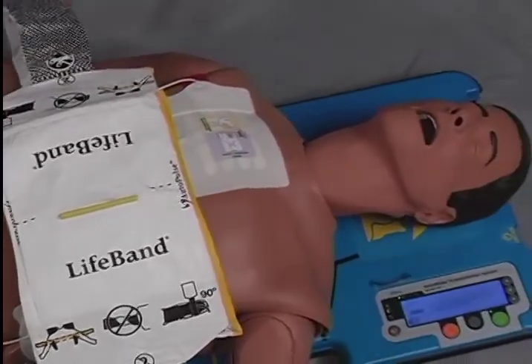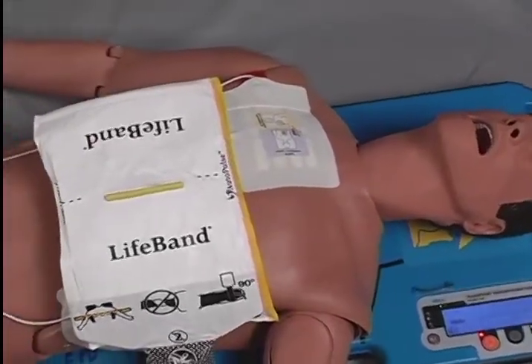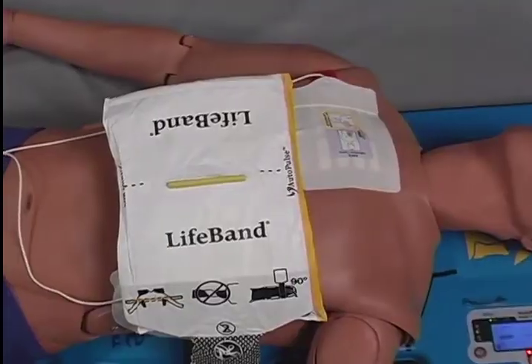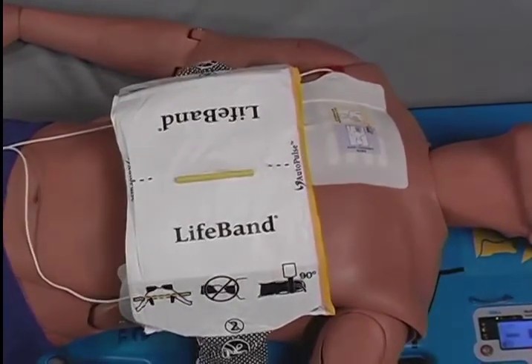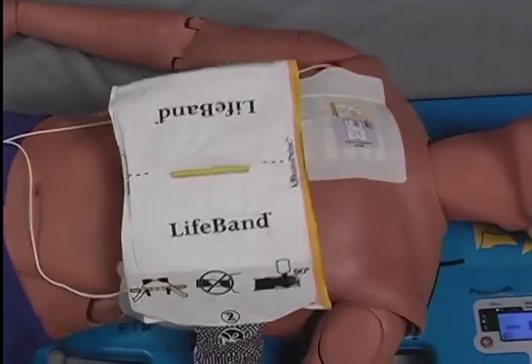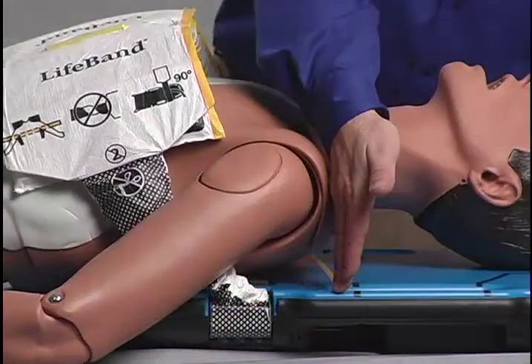The AutoPulse will automatically size the patient's chest, measuring the appropriate size, shape, and resistance of that individual, and then determine the force necessary to compress the chest the prescribed amount. No one should be touching the life band during this process. After sizing the patient, the AutoPulse will give you three seconds to check patient alignment.